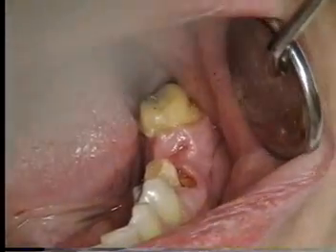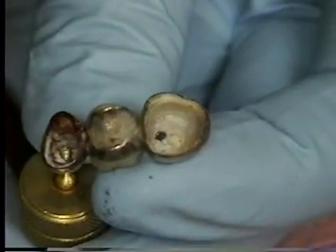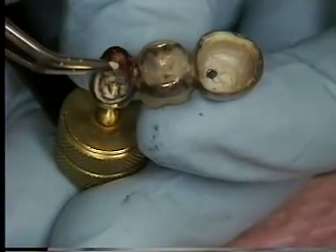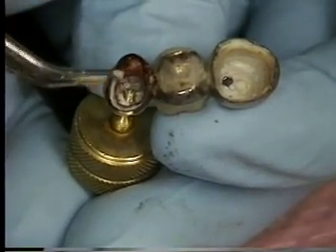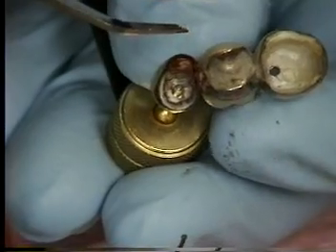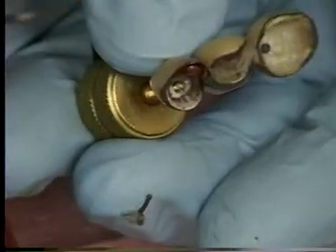So what we'll do now is extirpate the pulp, put some medication in it, and then she'll be comfortable and have a pleasant weekend after all. You can see here where the pulp was bleeding — it's right here on this buccal wall. This buccal is actually pretty deep, and that's where the pulp exposure was. But the bridge is fine and we can reuse the bridge once it's all cleaned out.